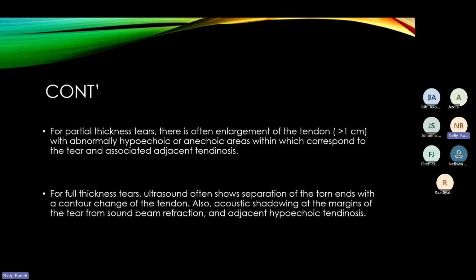So that is how you'd be able to tell that this is tendinitis. But tendinosis would be heterogeneous, and it would have mixed echogenicities. And it looks like that because of the micro tears that have been occurring over time.